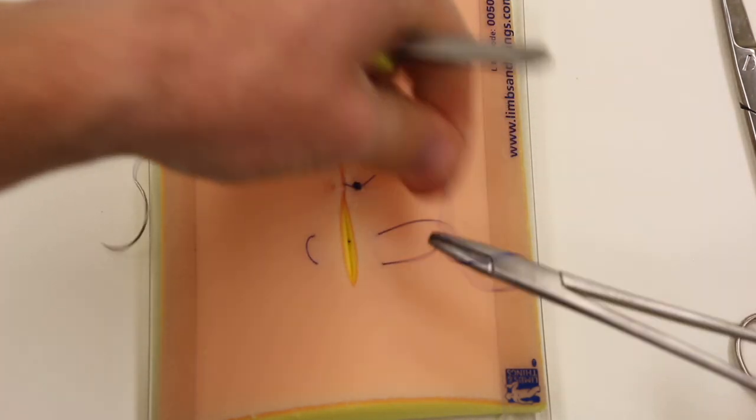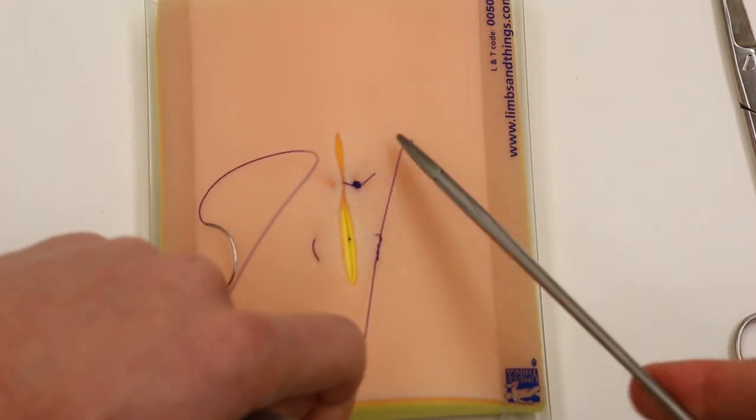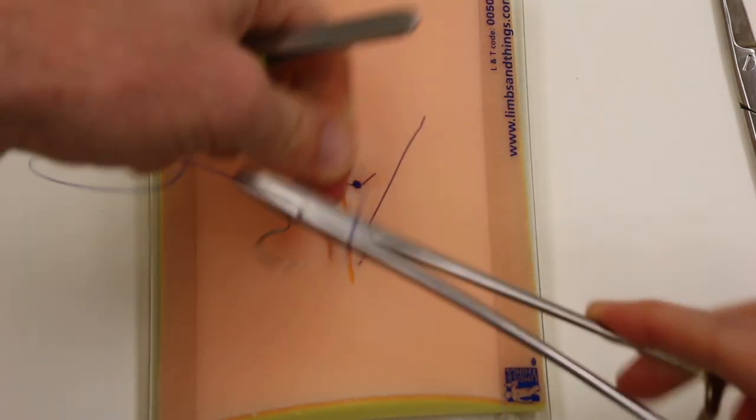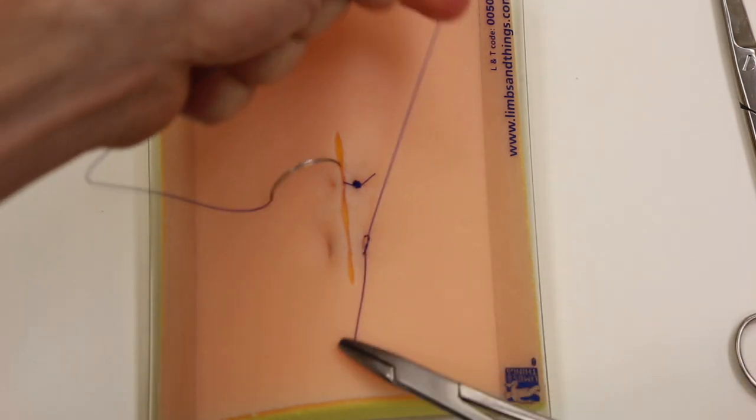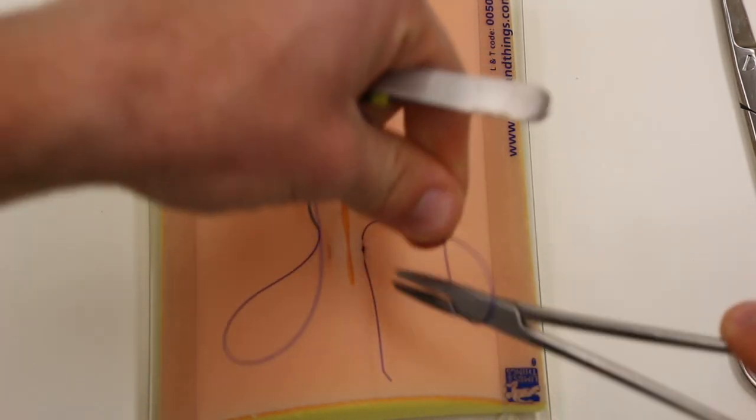Pulling taut. And then since we're using the same suture, you also want six knots.